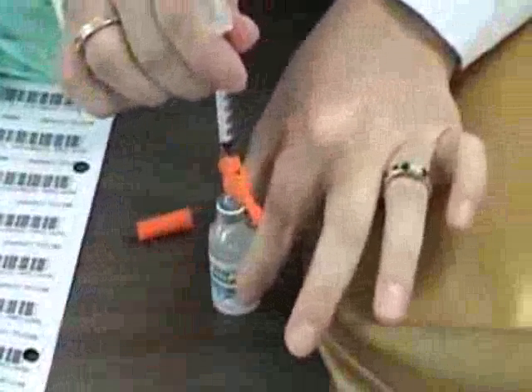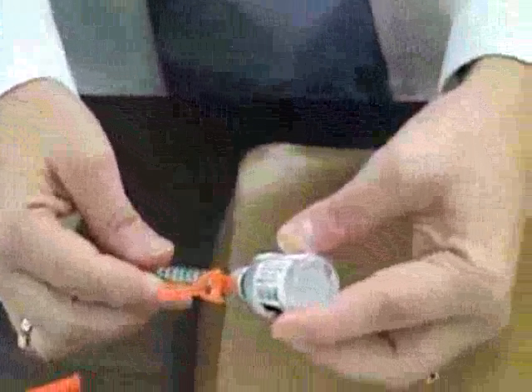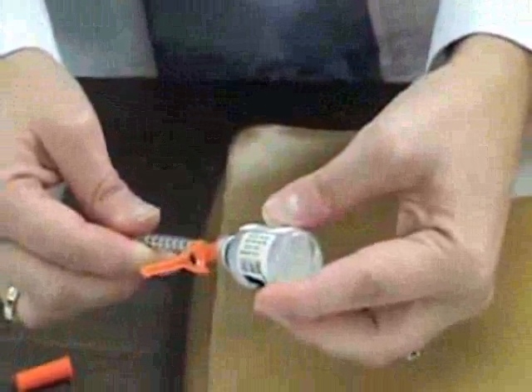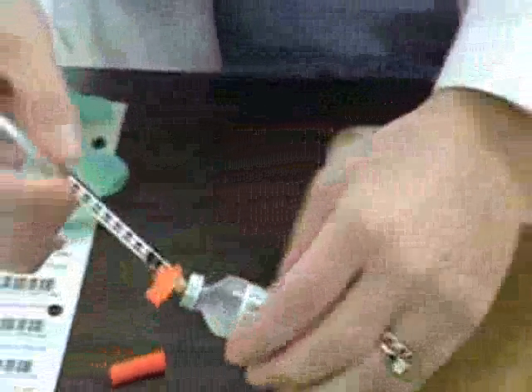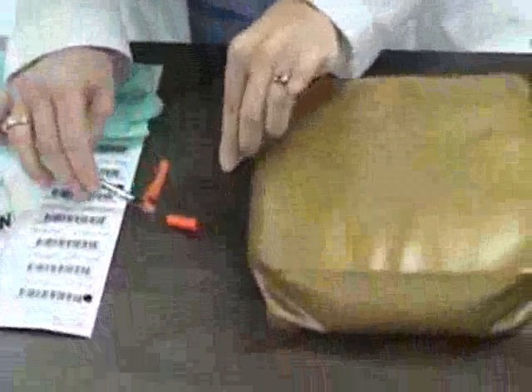I will inject the air into my vial, then invert my vial and withdraw my insulin. At this point, I will passively recap by scooping the cap and replacing.